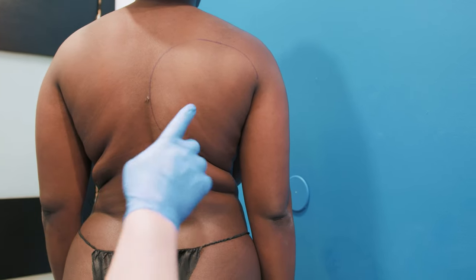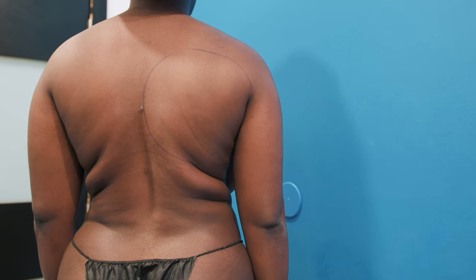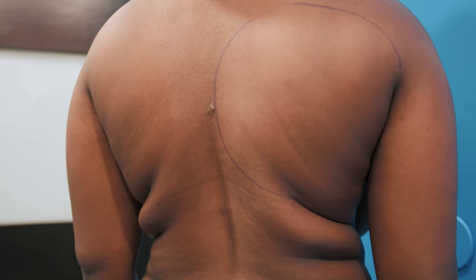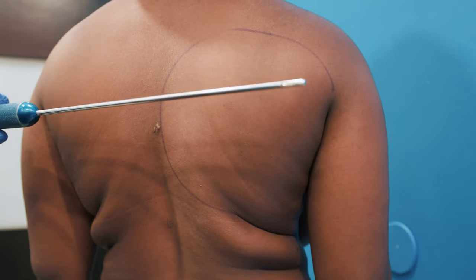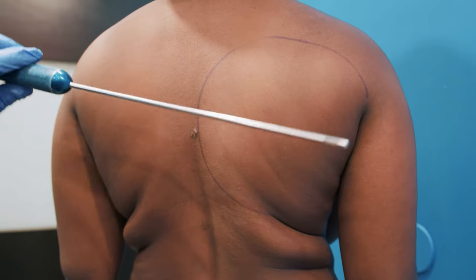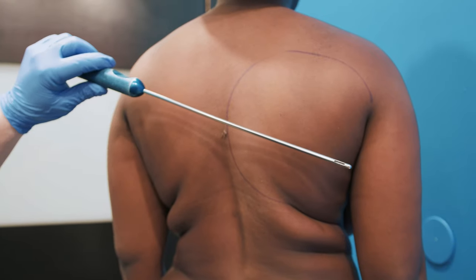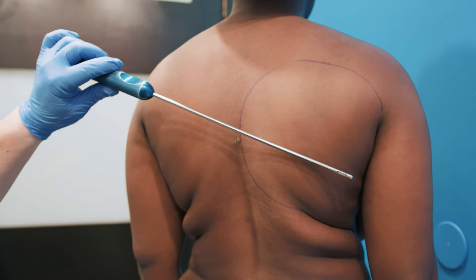The reason she probably didn't have this area lipoed is because you can see here was an incision for the lipo, and here was another incision for the lipo. This is a lipo cannula — they're straight and rigid. This one is fairly big; we don't always use this one, but for demonstration purposes it's perfect.